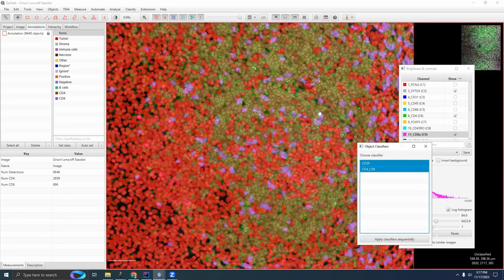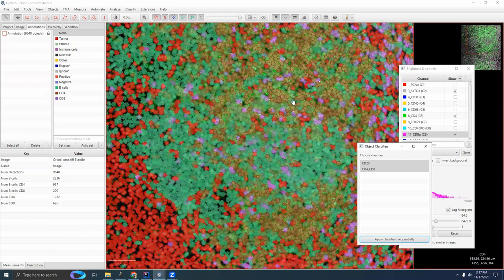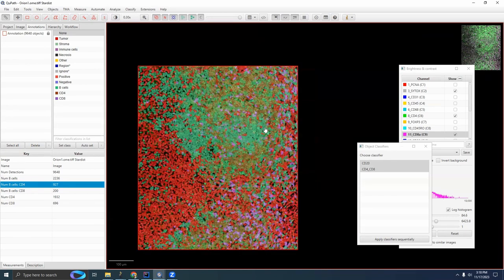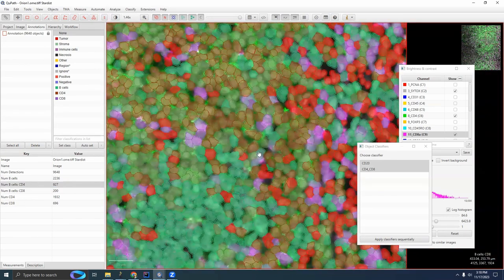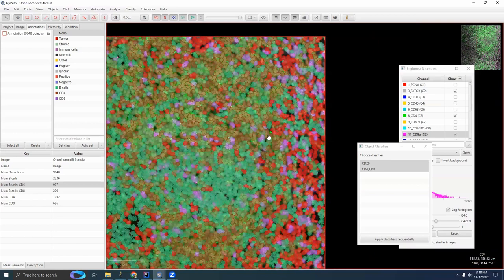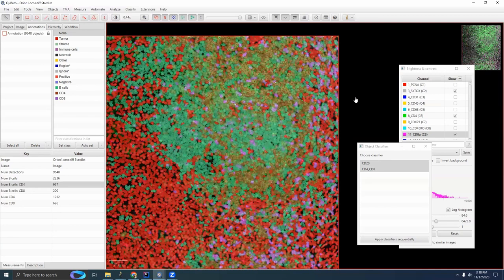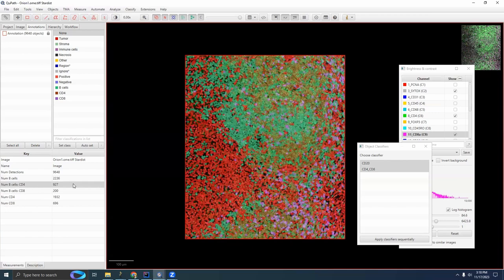If I try to apply both of these so that I get my B cells and my two types of T cells, which I can do through this, you can see in the results, I see 2200 B cells, 1900 CD4s, 700 CD8s, but also over 1,000 cells that come up as both CD20 positive and one of the T cell markers positive. And that's in large part due to the errors in my segmentation, or possibly errors in my classifier. In this particular case, I'm only looking at three classes, so it's not too big of a deal to just kind of ignore or in my head reclassify these cells that I know for sure to be incorrect.